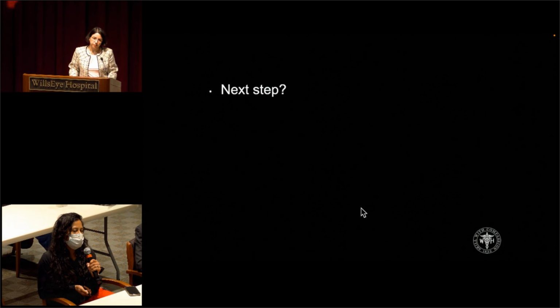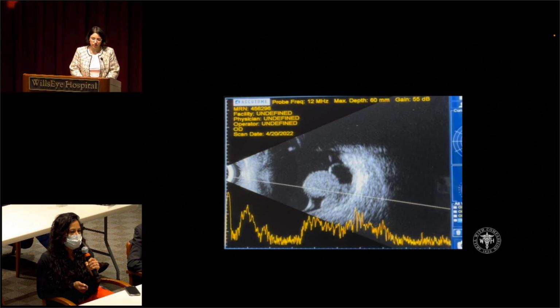Yeah, I think a B scan would be helpful just to see kind of what the echogenicity pattern is of this mass. So we performed a B scan. Great image. So this is a B scan ultrasound image, I'm presuming of the right eye. We see this large mushroom-shaped mass.